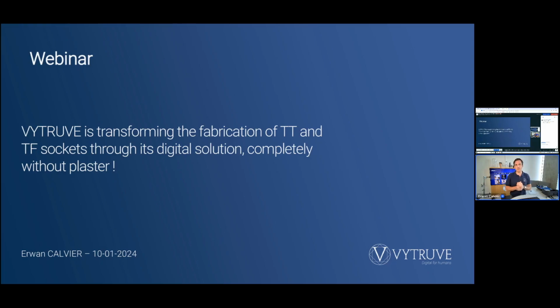My name is Erwan. I am the CEO and founder of Vytruve, but I am also a CPO. And today I want to talk to you about digital transfer, manufacturing for definitive socket, and many other things. So I'm really happy to be here.